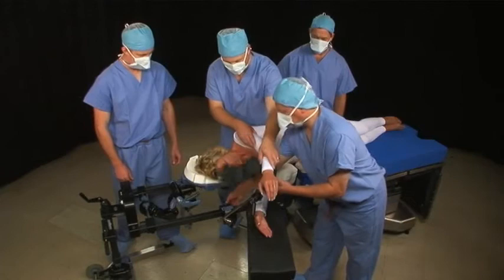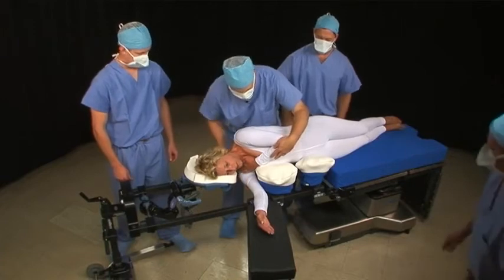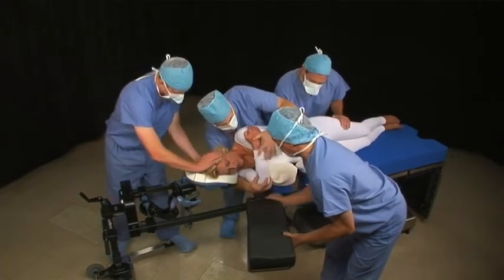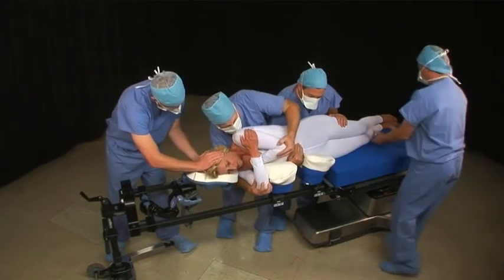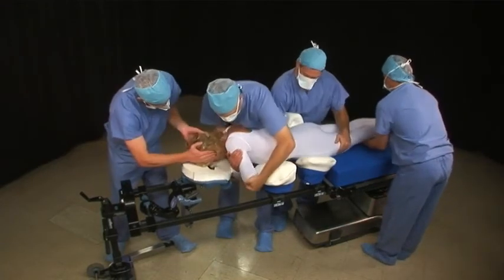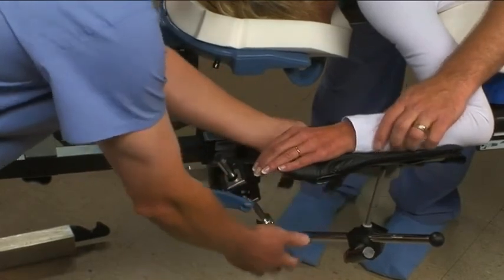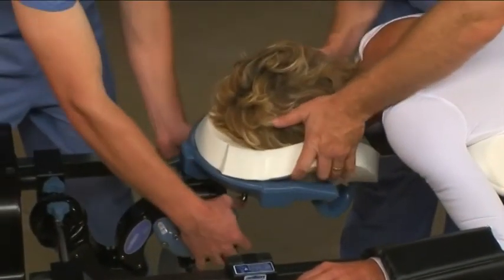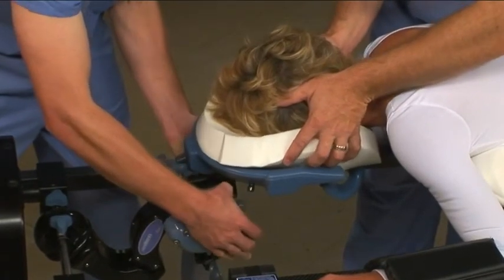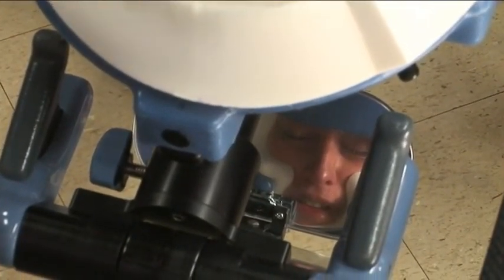For combined lateral and prone procedures, the patient can be rotated and repositioned right on the frame. Remove both arm boards and cross the patient's arms over her chest. Again, reach under the shoulders and hug the patient from behind as you lift and rotate, cupping the patient's lower elbow as you turn. Attach the prone arm boards to the frame and position the patient's arms at 90 degrees or less, being careful not to stress the brachial plexus. Adjust the patient's head position, making sure a second person guides the head during adjustment. Adjust the mirrors and check that the patient's eyes are free from pressure and that the chin is fully supported on the chin rest.